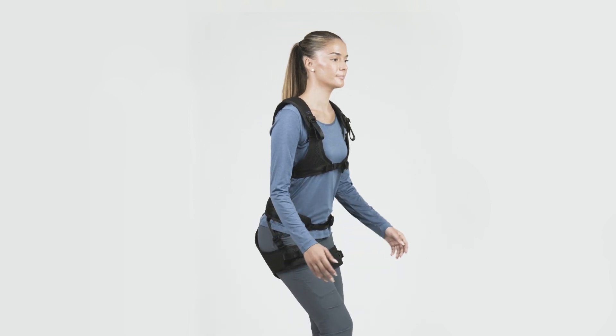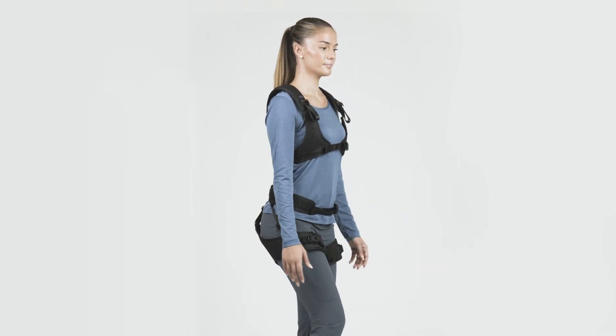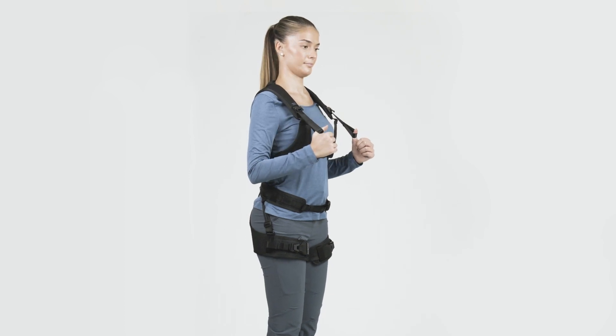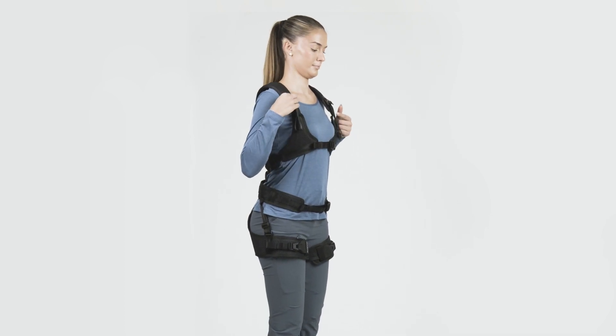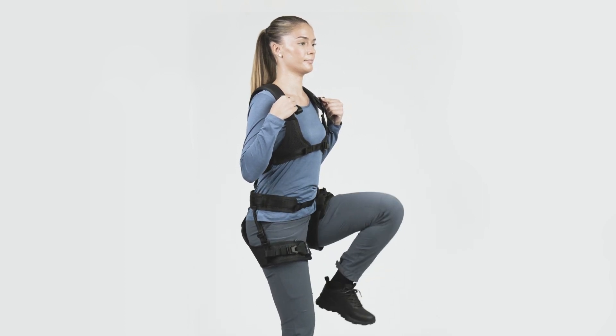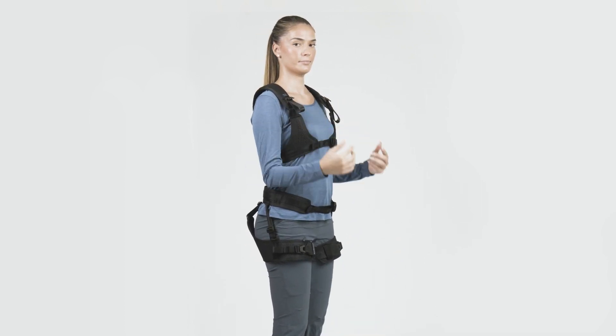When a task involves forward leaning or lifting movements, you can activate the LiftSuit back support. To activate the back support, pull the loops located at your collarbone. Deactivate the back support by lifting the buckles at the collarbone and raising your knees one after another.